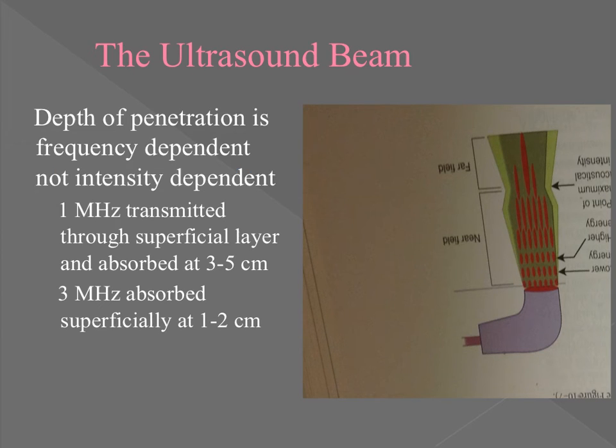All right. Next, we have the ultrasound beam. And so as we're looking at this ultrasound beam, I'm encouraging you to think about the depth of penetration. When we think about the ultrasound beam, the depth of penetration is frequency dependent, right? We've said this multiple times today. The depth of penetration, if it's 1 megahertz, that's going to be deeper. If it's 3 megahertz, it's going to be superficial.